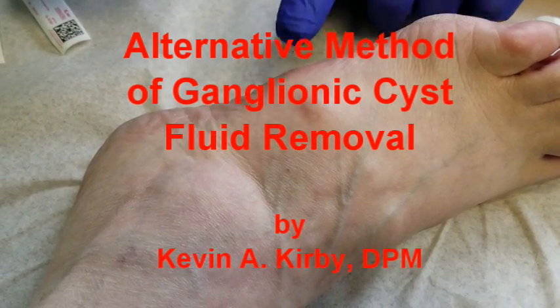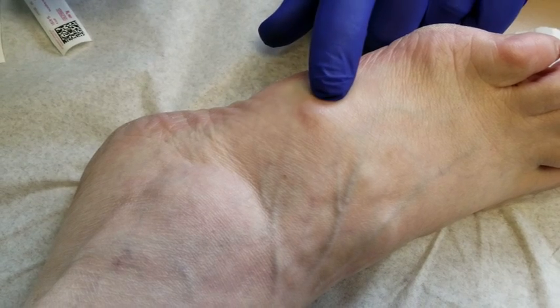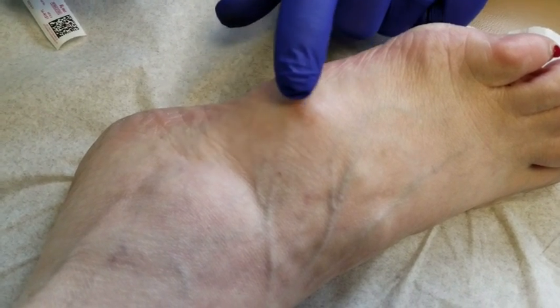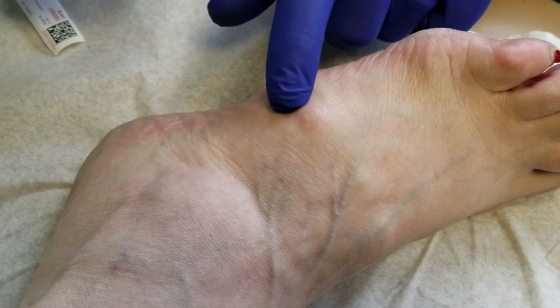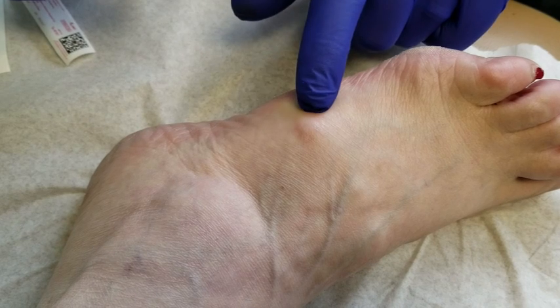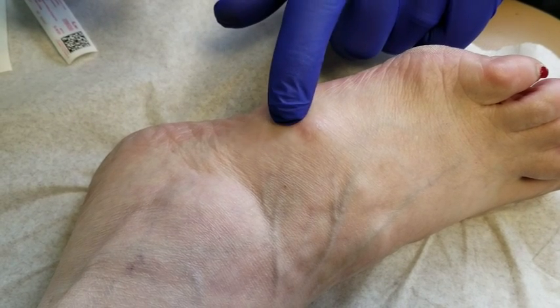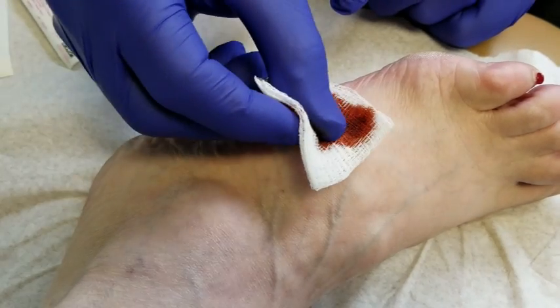This is Dr. Kirby. We're going to be taking care of a ganglion here on the lateral side of the foot. You can see the ganglionic sac is filled with synovial fluid. We're going to show you a technique by which to remove the ganglionic fluid without having to aspirate it.